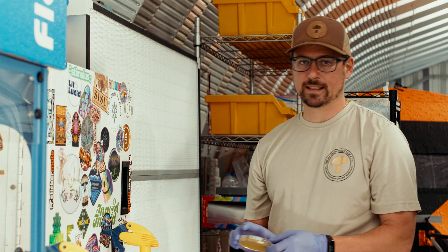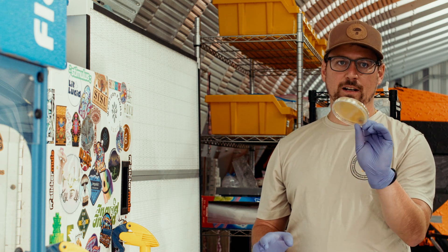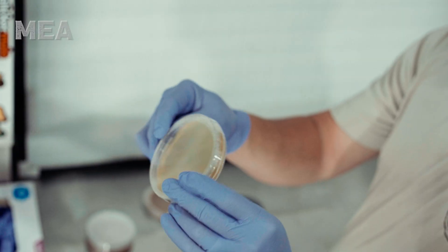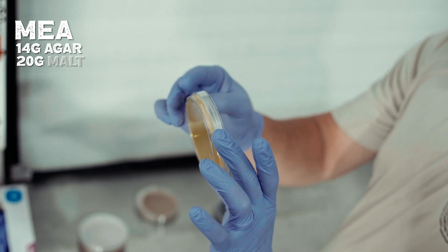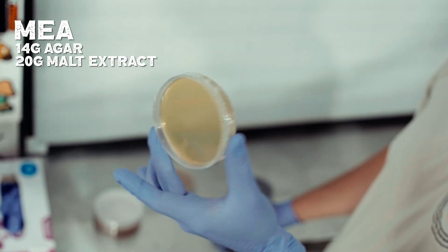Next up is a food grade malt extract agar, MEA. We've got 14 grams of agar and 20 grams of malt extract, and that's food grade.